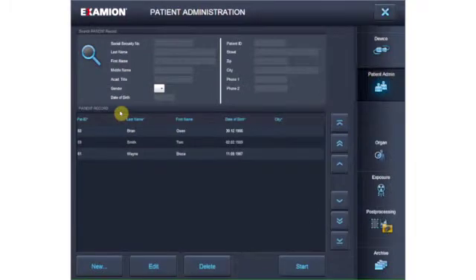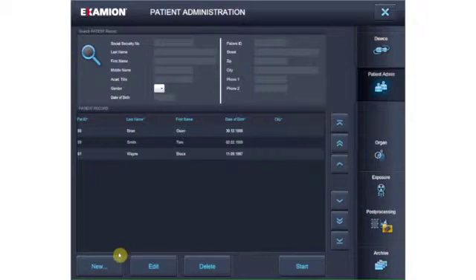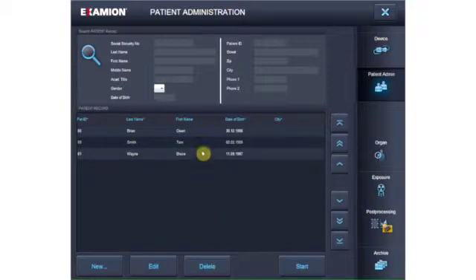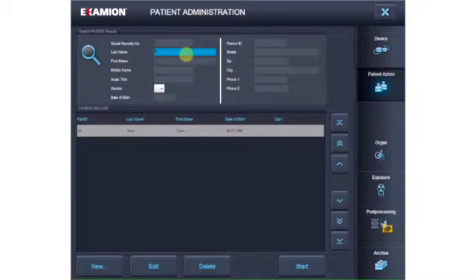As in every other practice management program, in Examion AQS patient data can be created, changed, added to, and deleted. To find a patient, just enter the patient data into the available search fields. If you already have practice management software, the orders can be seamlessly transferred into the Examion AQS software.